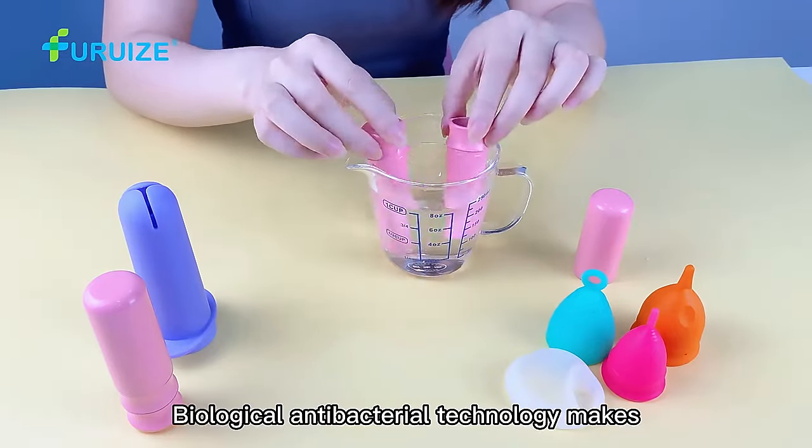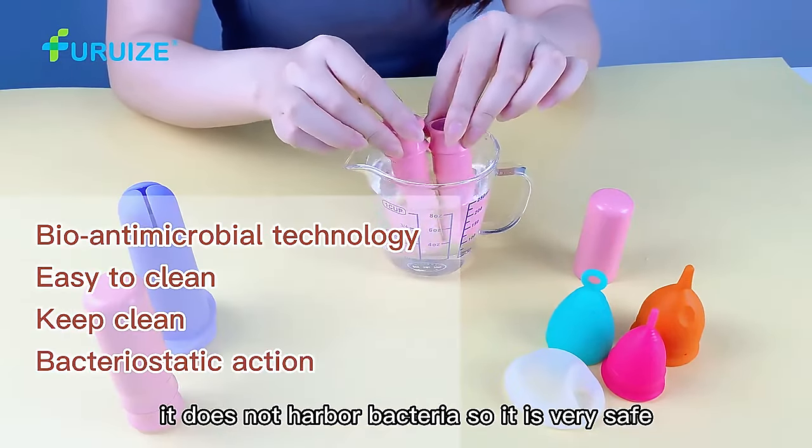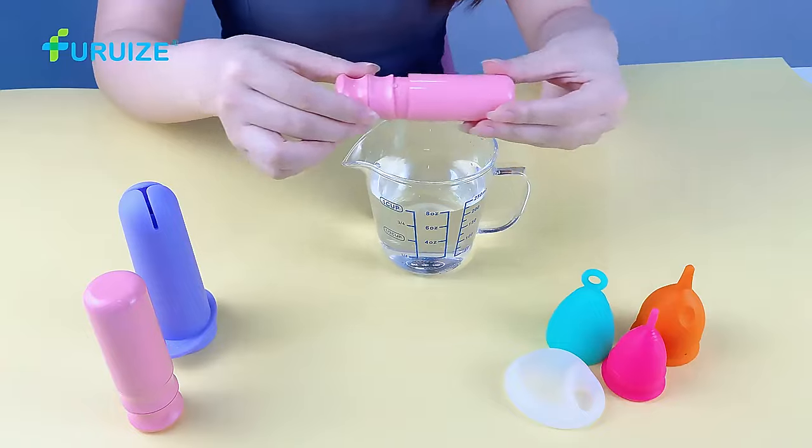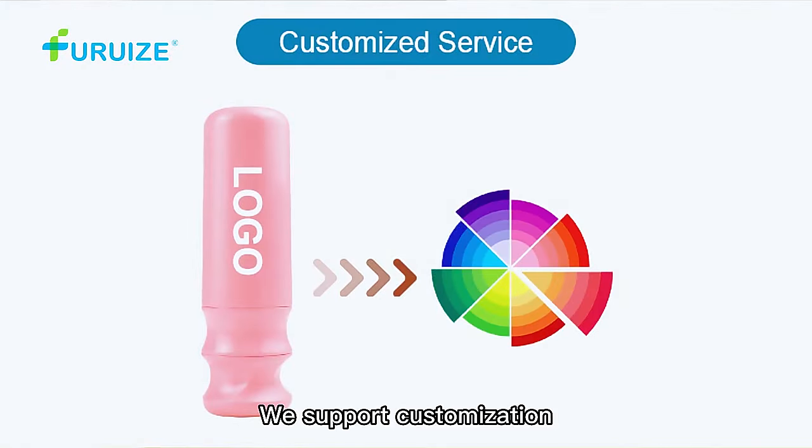Biological antibacterial technology means it does not harbor bacteria, so it is very safe. We support customization — welcome to consult us.